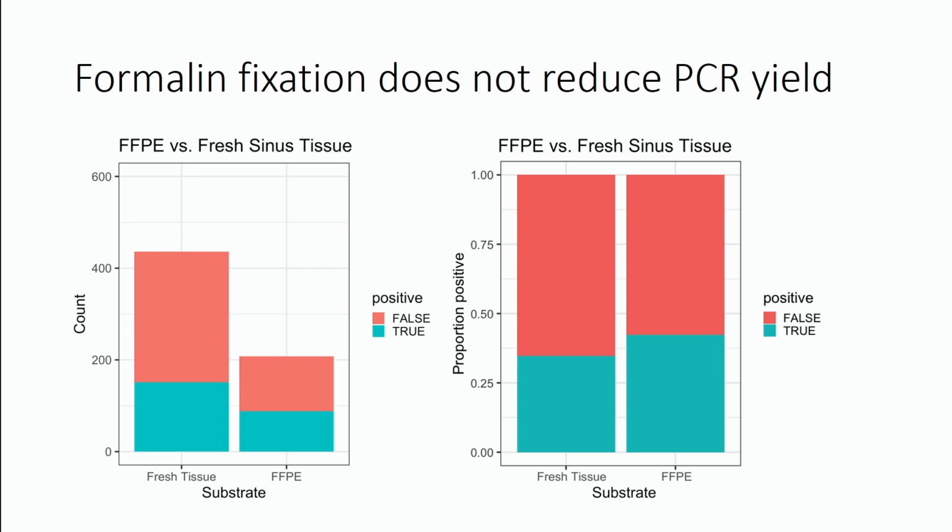And so I think the question is, how do you overcome the damage caused by formalin fixation or other pre-analytical variables? And so I think if you're a pathologist or if you're working with a pathologist, you get to say, oh, look, block A1 has not many organisms, block A3 has a bunch of organisms, but it also has bone and went through a strong acid decalcification, which is much worse for DNA, I would argue, than formalin.